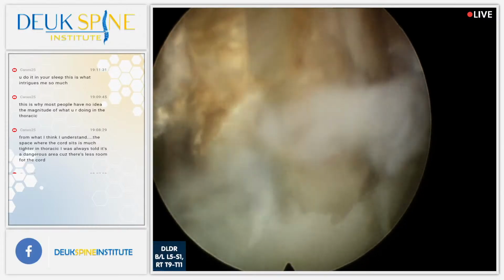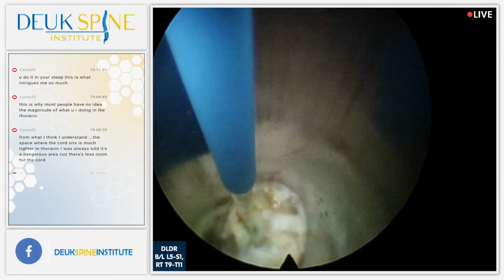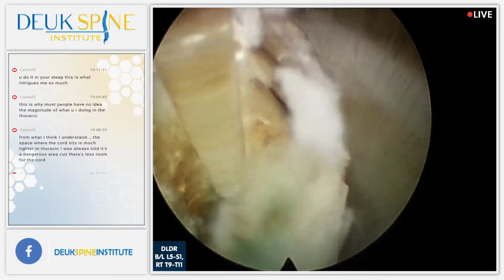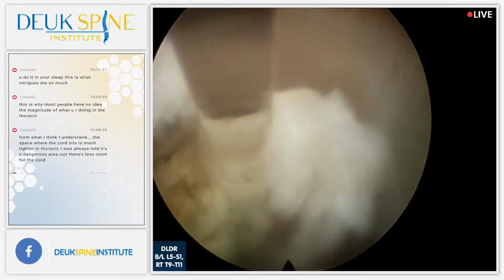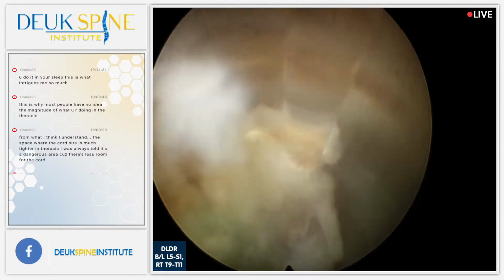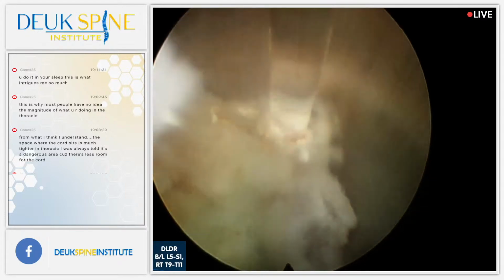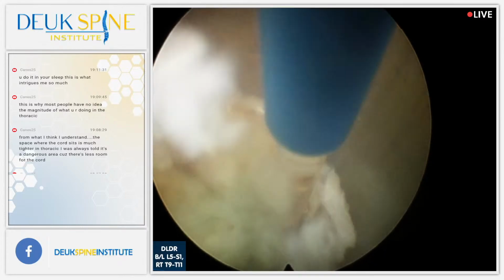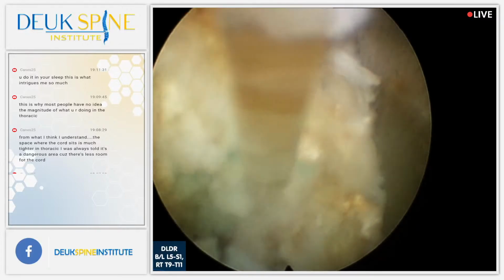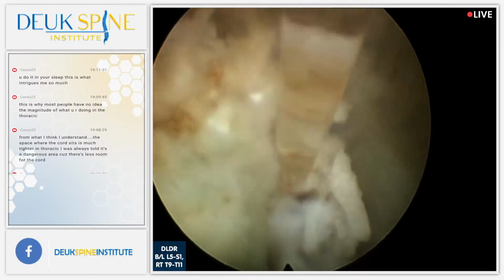Look at the scar tissue. It is massive. All of this scar tissue, all of it. There's a tiny bit of herniation right there, old, blue. I couldn't even get the dye in because it was just all caked with thick, thick scar tissue. Now the normal disc is soft. It's soft and fluffy, like the fur on a bunny. This is like rubber, really hard. I can feel it with my laser. Look at the laser. It's hitting it and it's doing almost nothing.